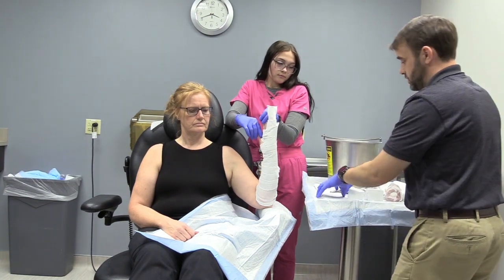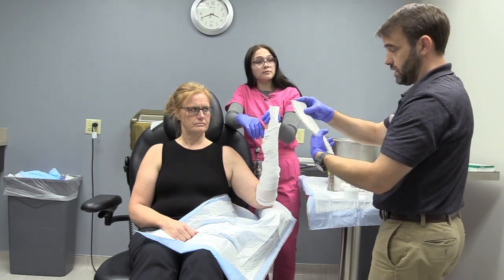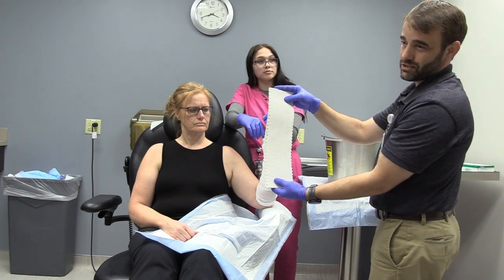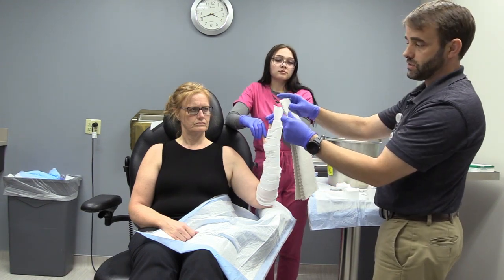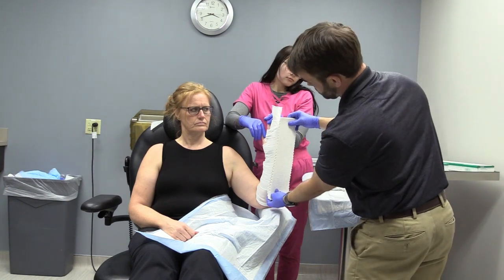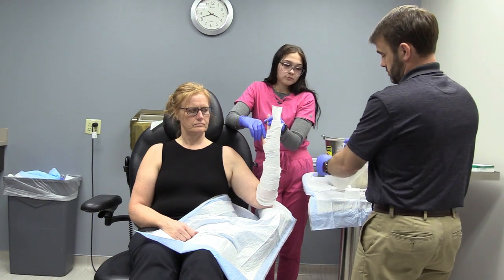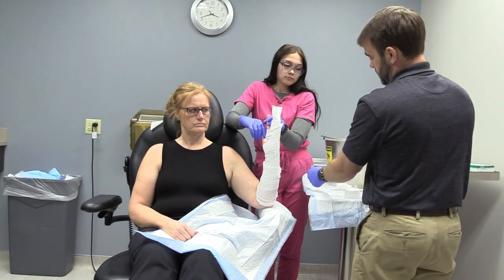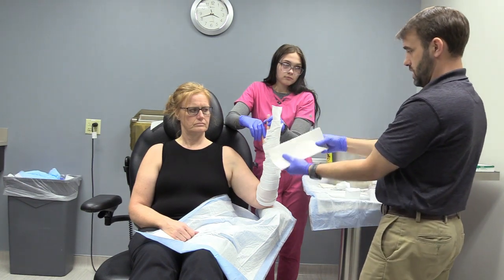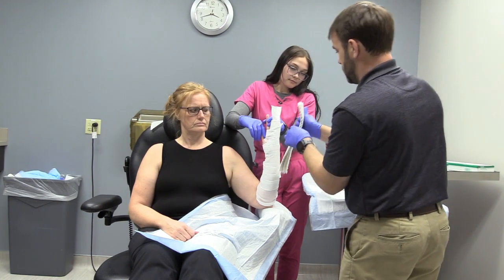Alrighty, and then once you have what you need, I get my 10 layers, or whoever's helping me will get 10 layers of, I'm using 4-inch in this case. You can kind of tailor it based on size. If it's too big in any direction, you can always rip it. So you can see this one, I want it about that long, so I'm just going to rip it. If you want to do fewer layers at a time, you can. If you want to practice, phone books aren't really used anymore, so you can do that. Alright, and I like this, so I'm not going to narrow it at all.